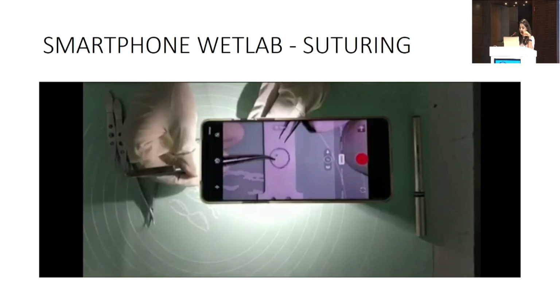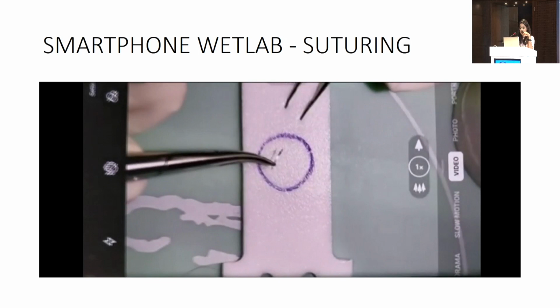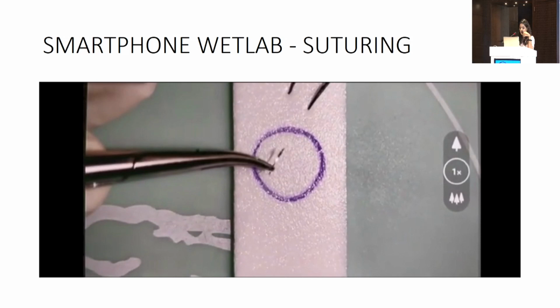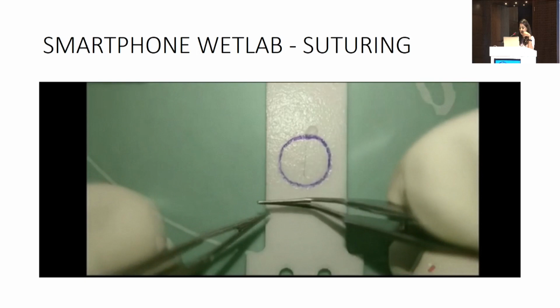So your camera is the eyepiece and your screen is what you have to look at. With your magnification increased, you can have very good visibility of the surgical field. The only drawback is that you will not have good stereopsis with this when you compare it to a microscope. This is a video of our resident practicing suturing on thermocol.